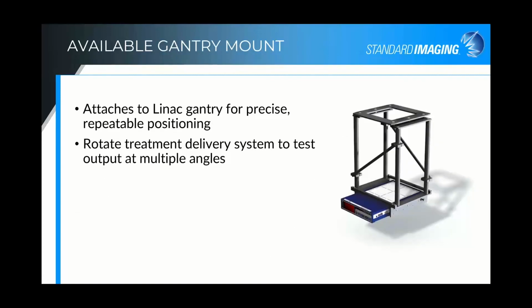Got a gantry mount, so if you want to take measurements for precision at repeatable angles, you can certainly do that as well. So that will allow you to check your constancy and your symmetry and flatness and how that is maintained at various angles of the rotation of the gantry.